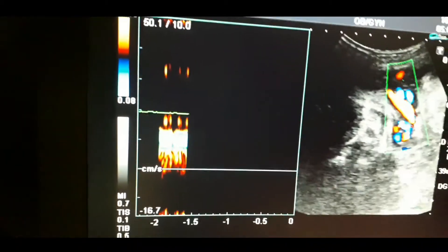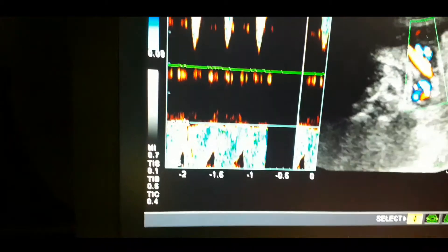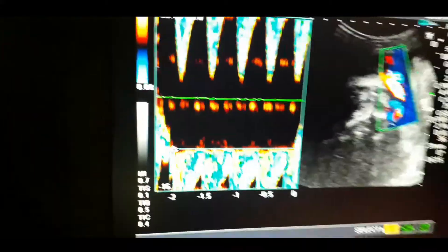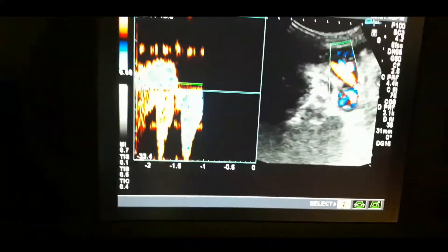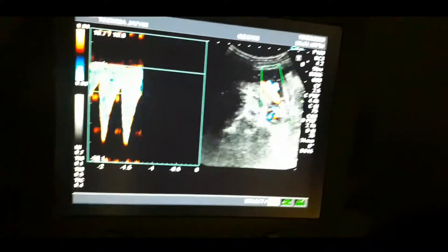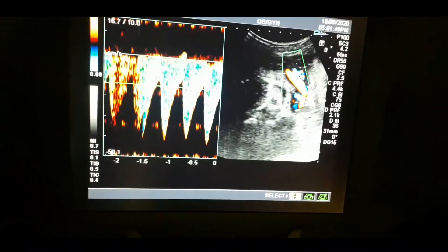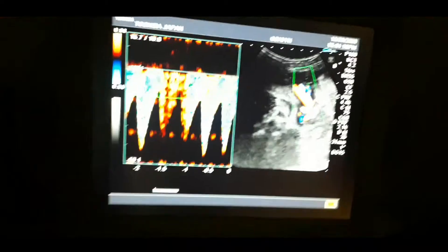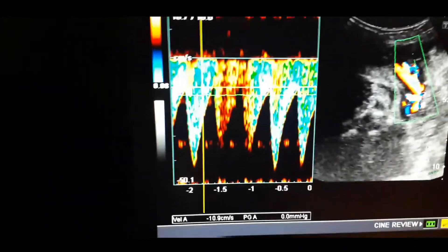You can also calculate the S/D ratio from the umbilical cord. Here, I am going to calculate the blood velocities in the vessel. You will calculate the peak systolic and peak diastolic velocity to calculate the S/D ratio.